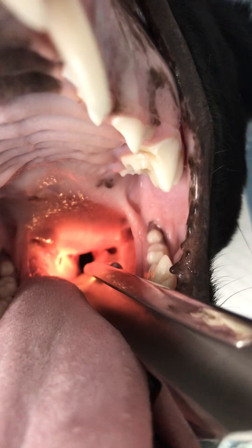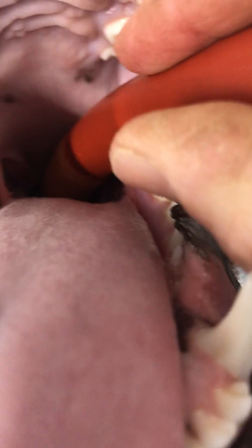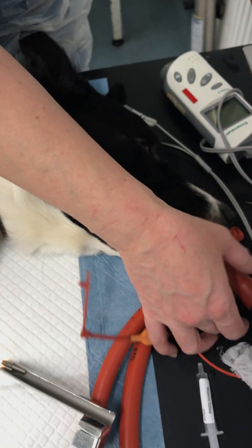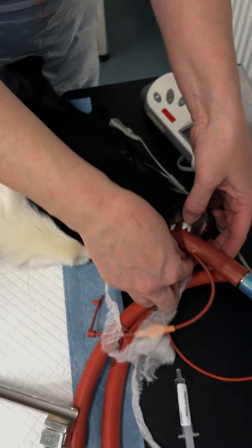I'm just going to drop down the phone in order for me to do that. Right now he's got a tube down his airway and we can maintain him on general anaesthesia.